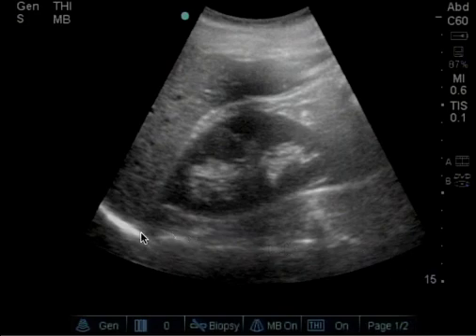We see the spinal stripe, we see the diaphragm, we see the liver, and we see the kidney.